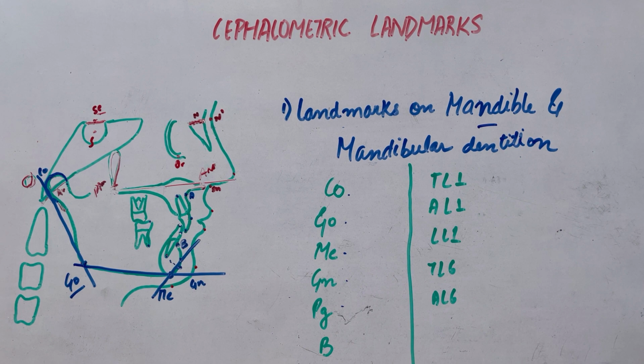Now, these were various cephalometric landmarks that we use for various analyses in determining the discrepancy in the anterior-posterior direction on the lateral cephalogram.